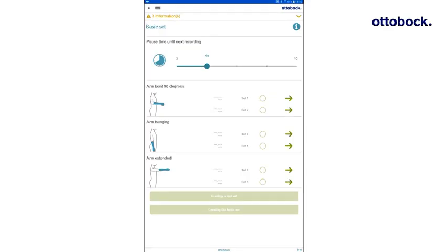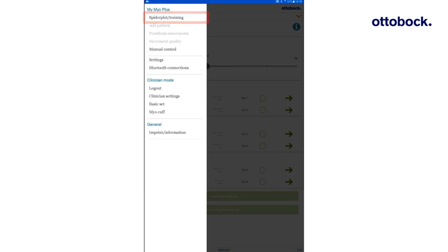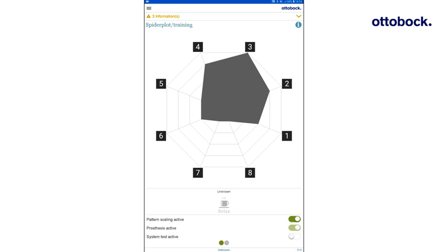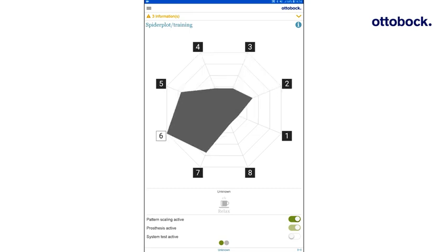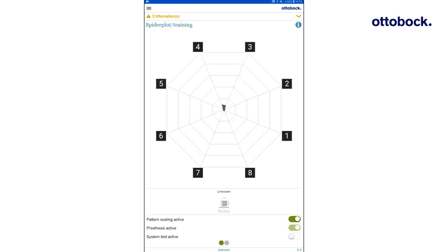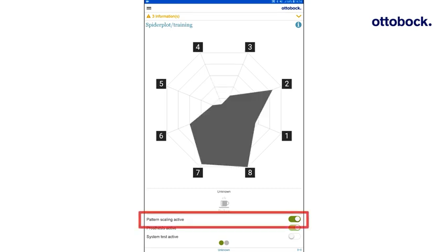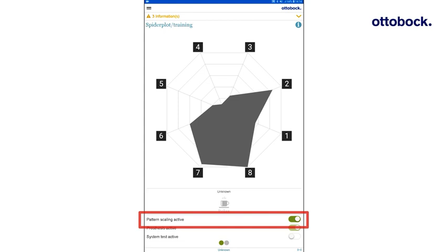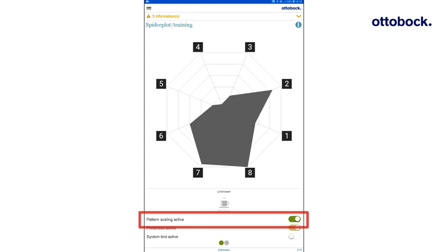Before the first recording, it is important to evaluate the user's movement patterns. Therefore navigate to the Spider Plot. The Myo Plus app displays the user's current muscle activity in the form of a Spider Plot. This visualization displays each electrode signal on an individual axis, so that the signals form a pattern. The signal intensities can be displayed by disabling Pattern Scaling. However, Pattern Scaling is recommended as this magnifies the visualization, making it easier to see the difference between movement patterns.